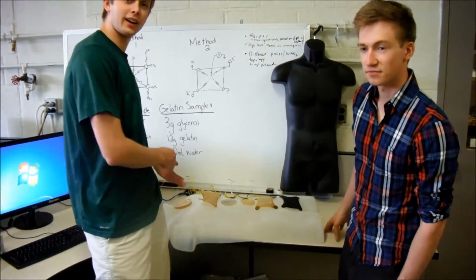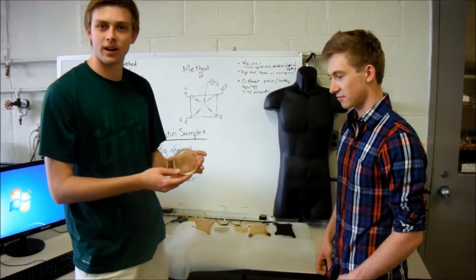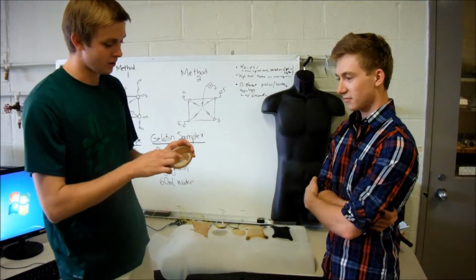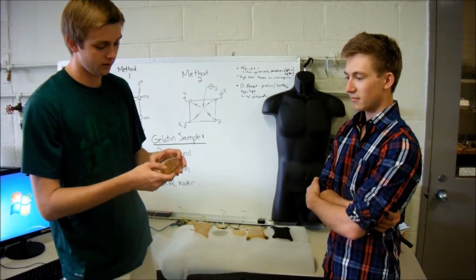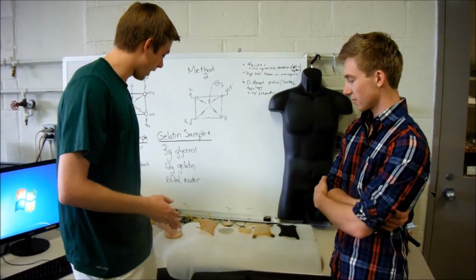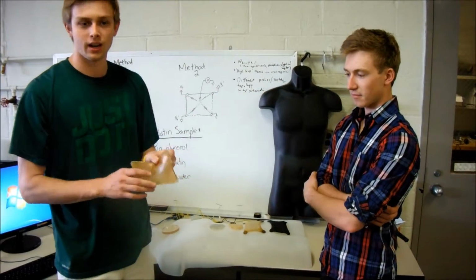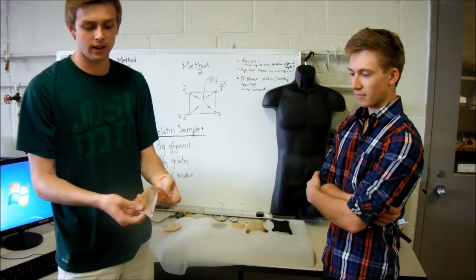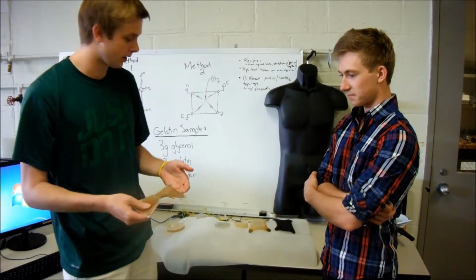So we've got a chronological order of our different types of samples. This is a sample that we made a mere half-hour ago, and as you can tell, it's already pretty dry, and it's very malleable and ductile. It's good. It represents skin a lot. However, what we noticed is after a couple days, maybe a week, it gets to be much more plastic-like, and it's not quite as ductile, and it's not as good to represent skin.